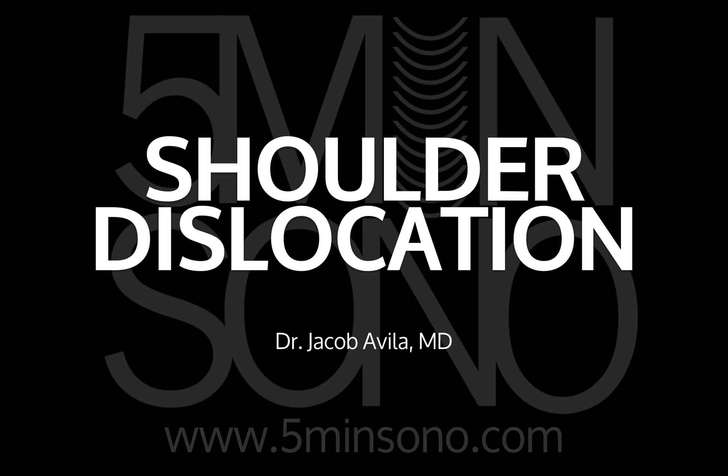Hello, this is Jacob Avila of 5-Minute Sono, and today I'm going to show you how you can use ultrasound to identify shoulder dislocations.